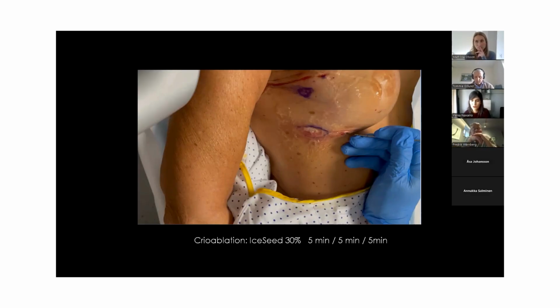And the key is to lose fear, especially with the skin. You can see with this that we can protect the skin very easily and with no complications after the procedure. Second, when we treat the skin, what we do is what we see here. First, we localize the lesion with the ultrasound.